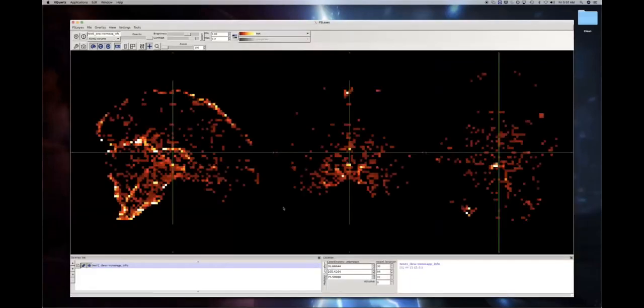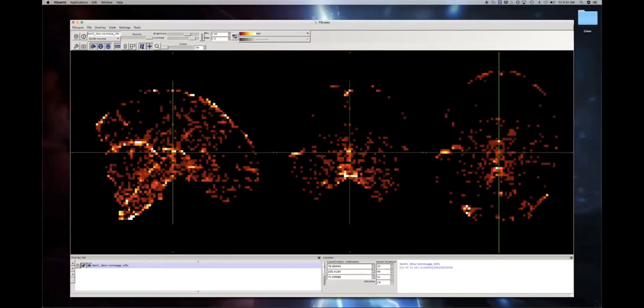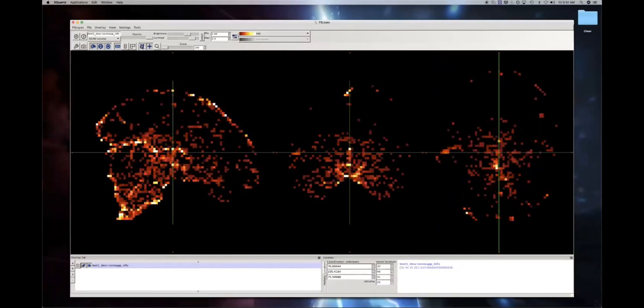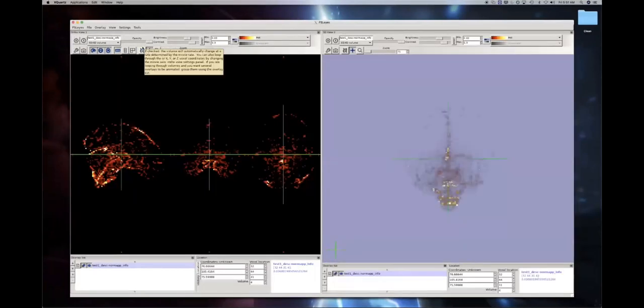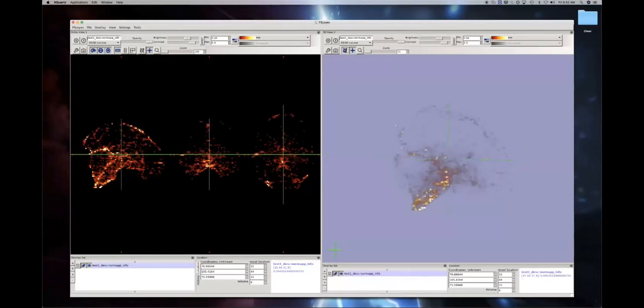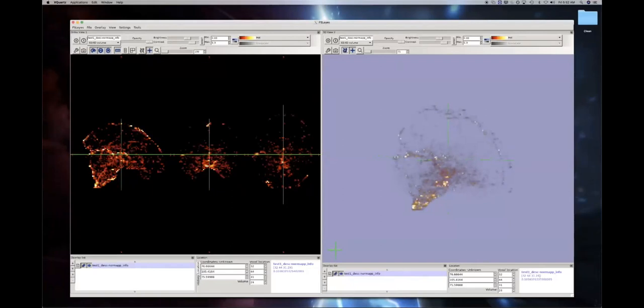You can also just plot it and then do the contrast and the map here. And you can follow the signal throughout the brain in 2D or Control 6 in 3D. And you see this beautiful video where you can slightly make out the vessels. You can also interpolate so it's more clear, or we can directly go to the vessel map.